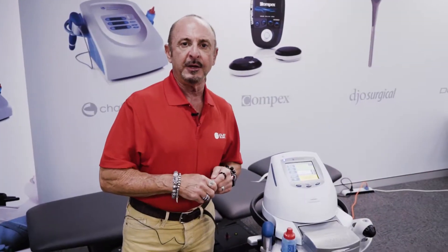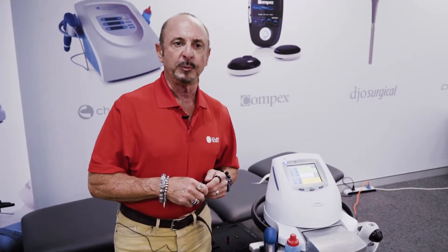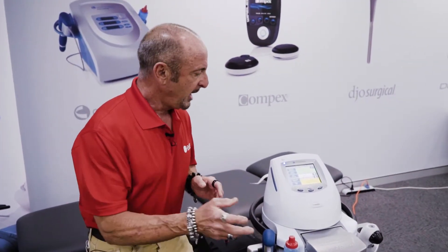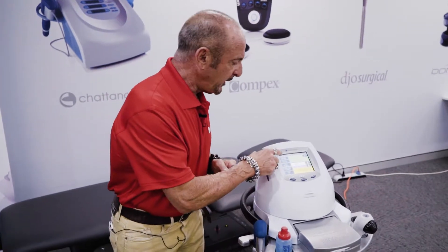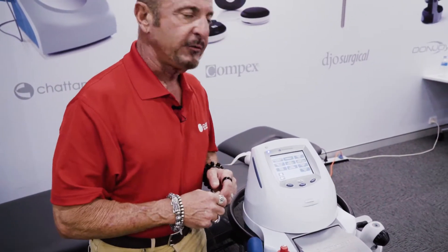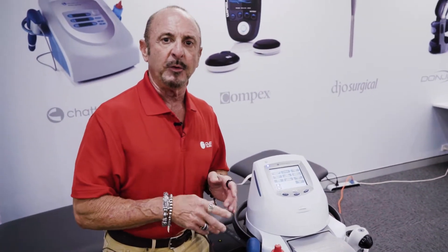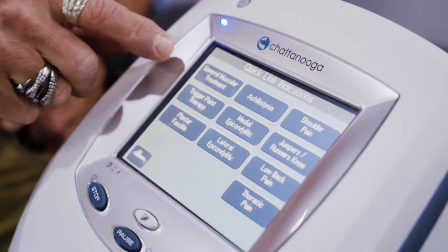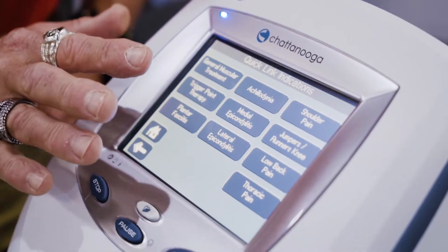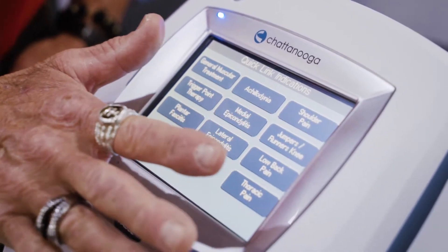As mentioned, the guided user interface on our radial pressure wave machine — if I come over here to the quick links, there are the ten most common musculoskeletal disorders a clinician would find in practice.